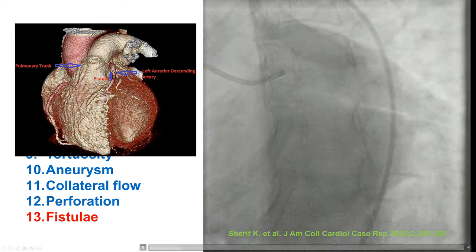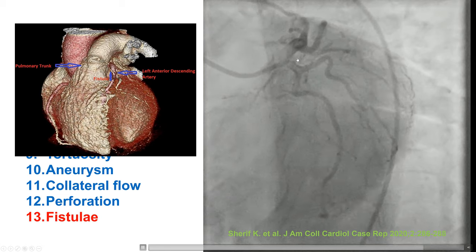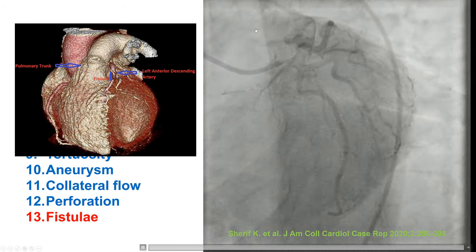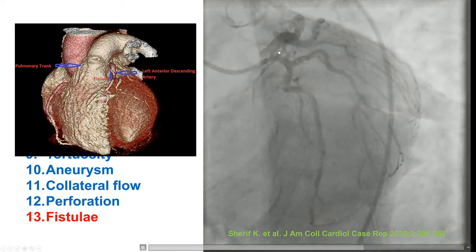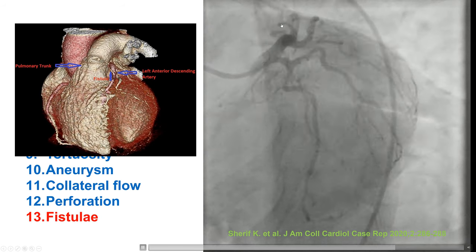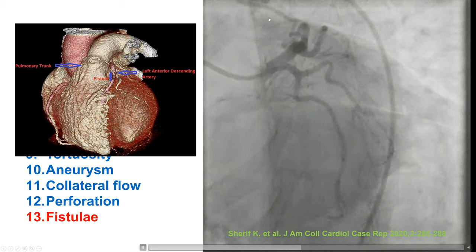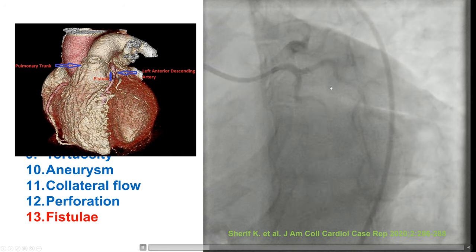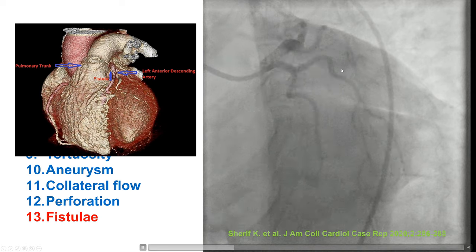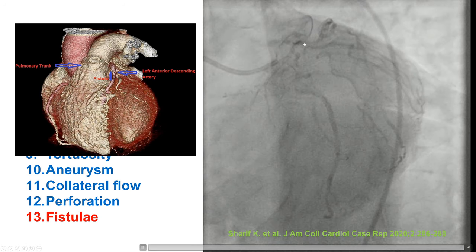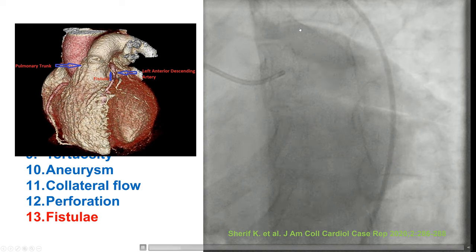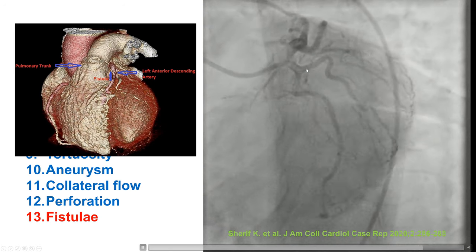Last, there are sometimes fistulas, which are connections between the coronary artery and other structures. This is an example of a fistula going from the LAD into the pulmonary tract. These fistulas are infrequent, but if there is significant flow, they can form a focus for endocarditis and may need to be occluded either percutaneously or surgically.